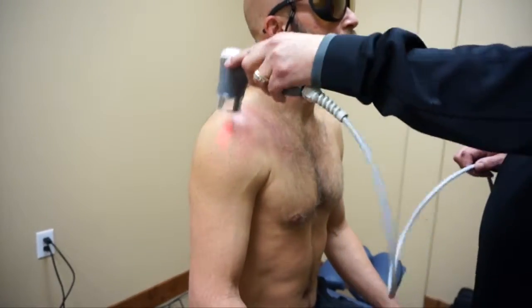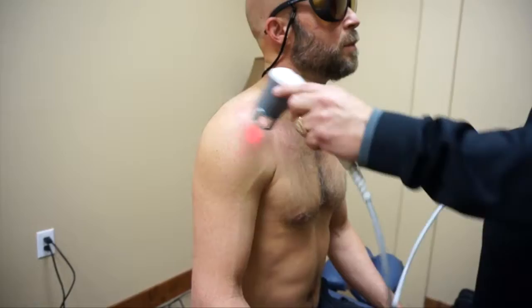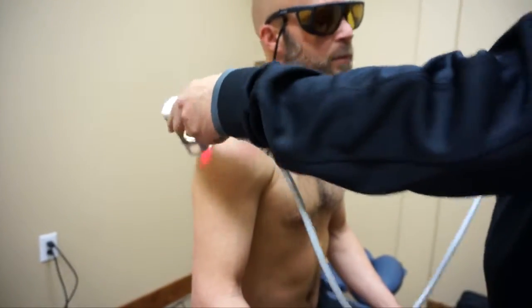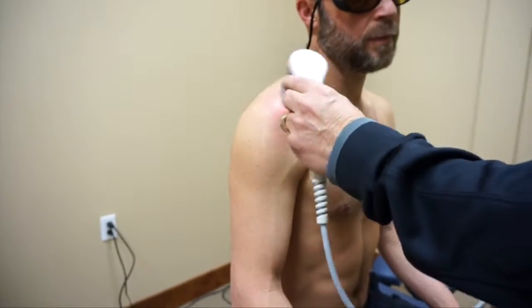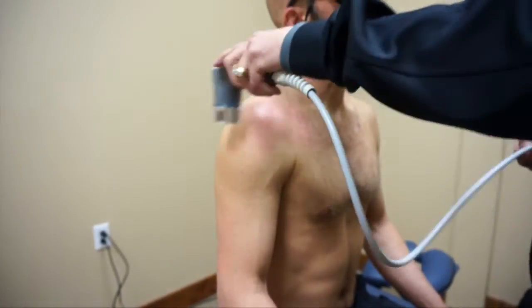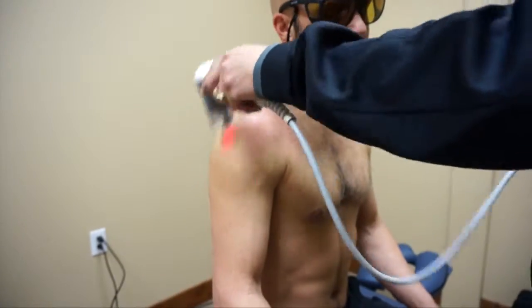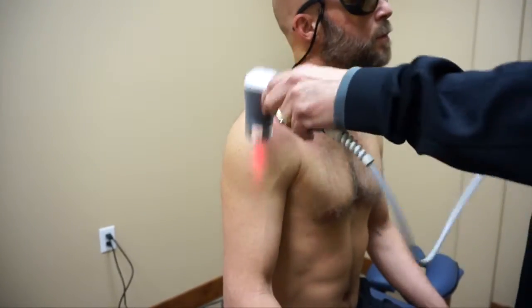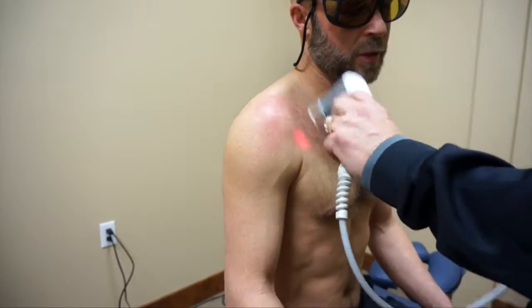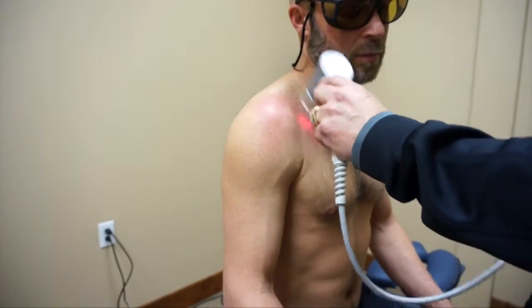Each time it would hold better, and hopefully I wouldn't see him at halftime. The nice thing about this is the speed — I can do in two minutes what other lasers take 20 minutes for. And when you only have a six-minute halftime and 45 players, only the starters will be in there.